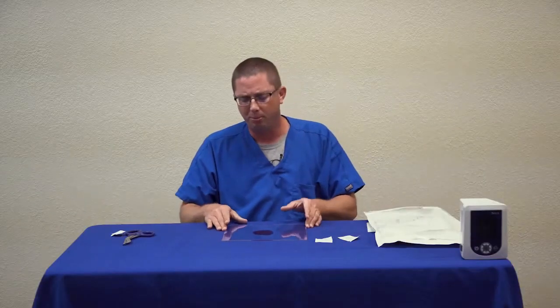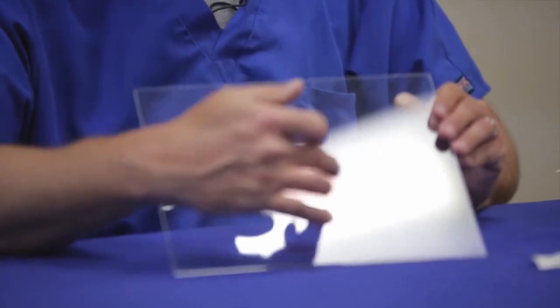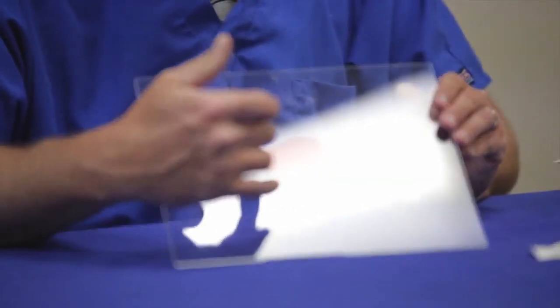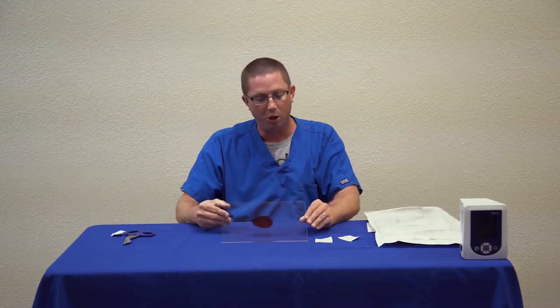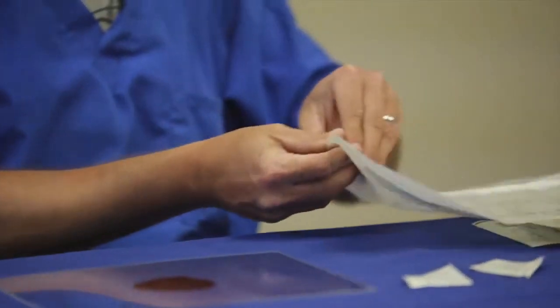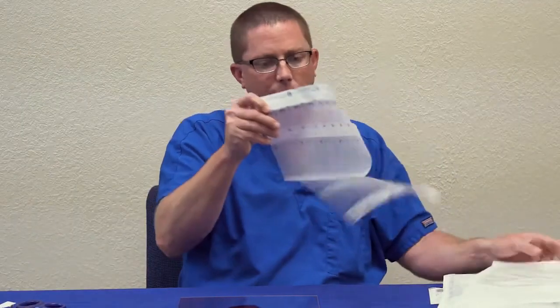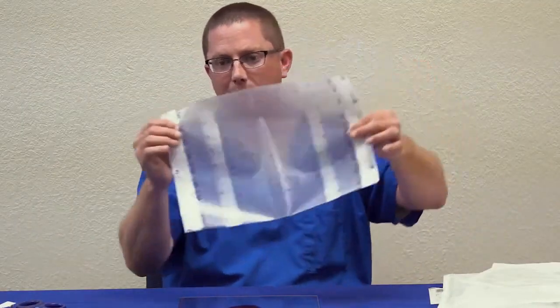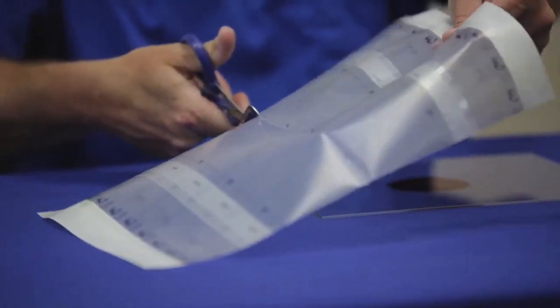One of the basic principles of negative pressure wound therapy is you never want foam touching good skin around the peri-wound area. So the first item after skin prepping it would be to take your drape and remove it from the package. As you can see, your drape is an 8 by 10 sheet. Cut the drape in half.